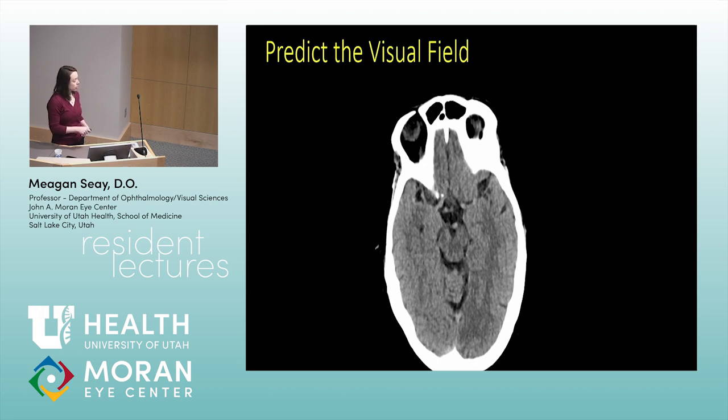So this side is normal, but this hypodensity is the terminology for a subacute to chronic stroke. Acute strokes, in the first 24 hours, look normal on CAT scan. This one's a little bit tougher because MRIs are much easier to show things like this, but I didn't have one on this patient. So where are we in the brain? This is the abnormal side.